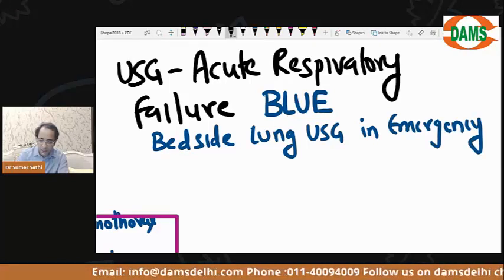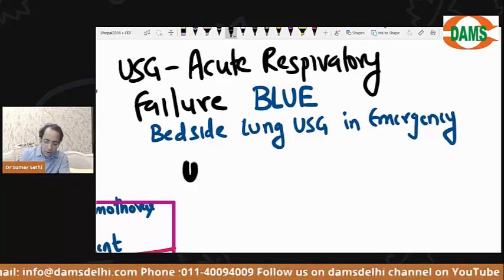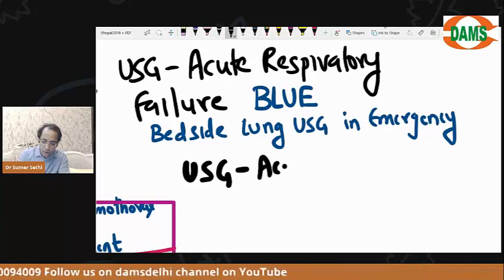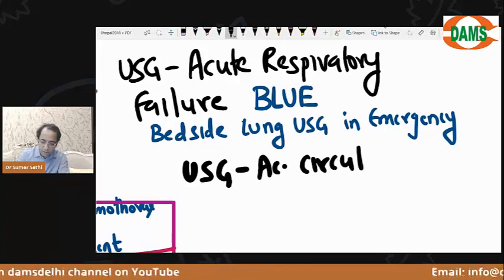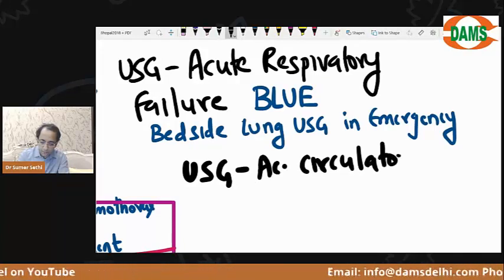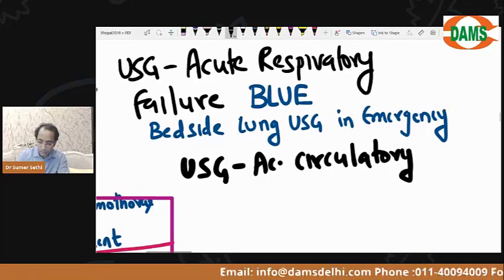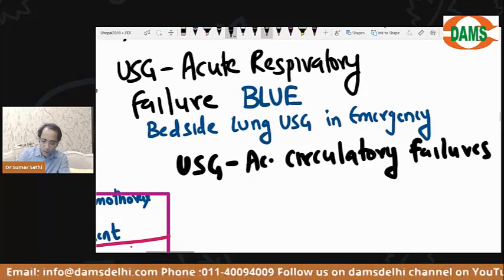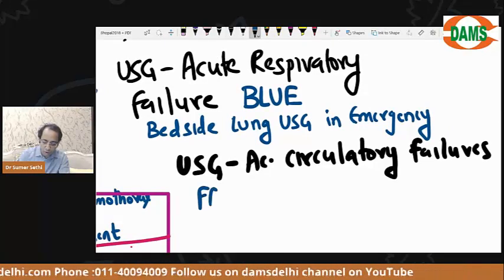Similarly, today in ICU, we even use ultrasound in acute circulatory failure. Then we use the word FALLS protocol.